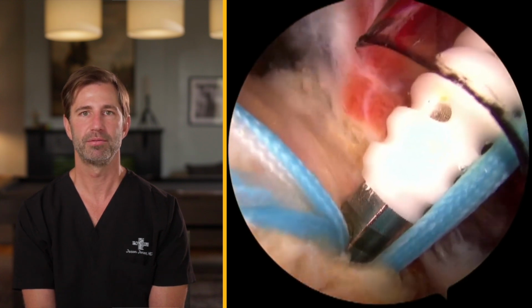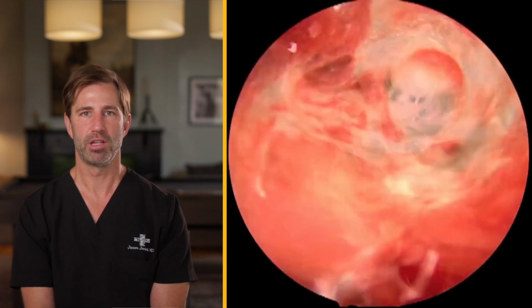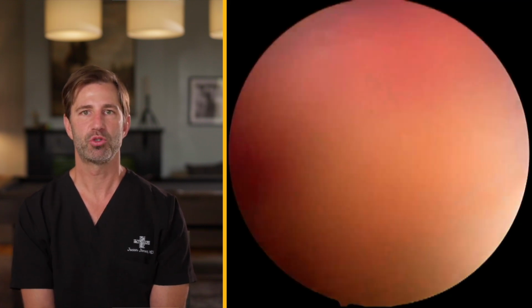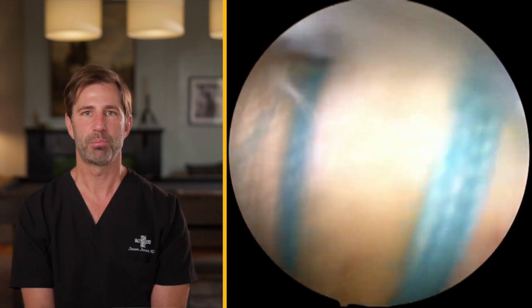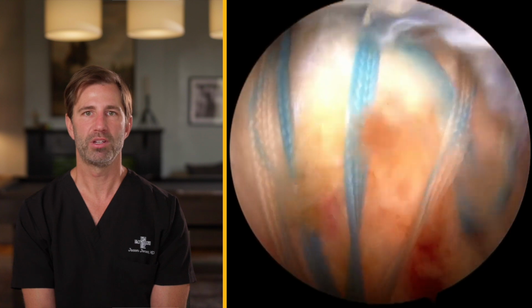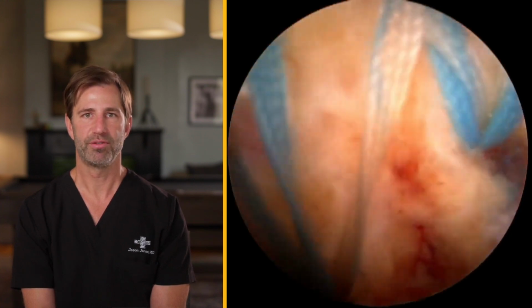At this time, we've finished the rotator cuff repair. All the limbs are demonstrated in this shot. What you see is a well-reduced rotator cuff with good compression against the footprint, and this will go on to a healed and very viable and pain-free rotator cuff with full function.